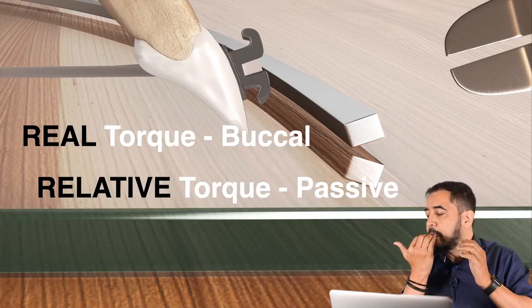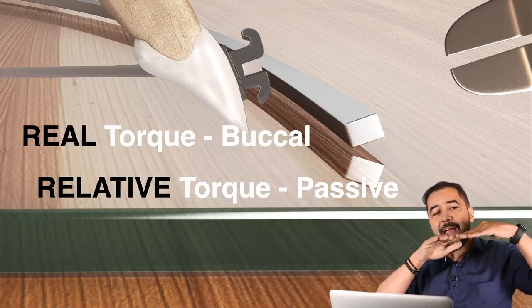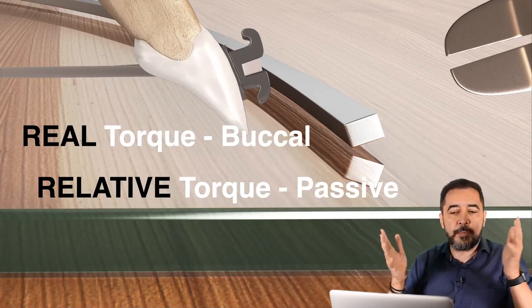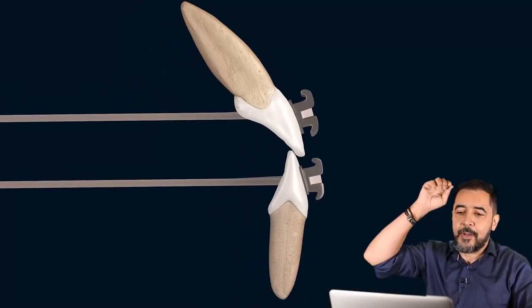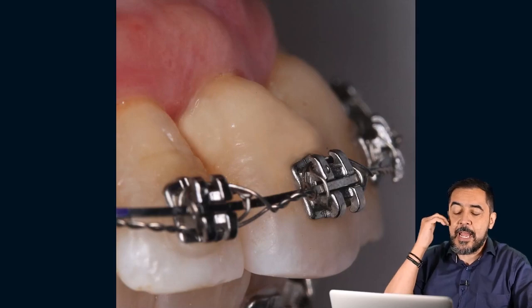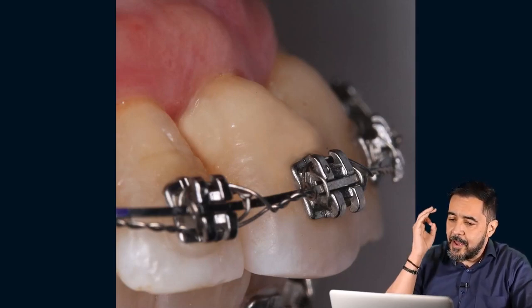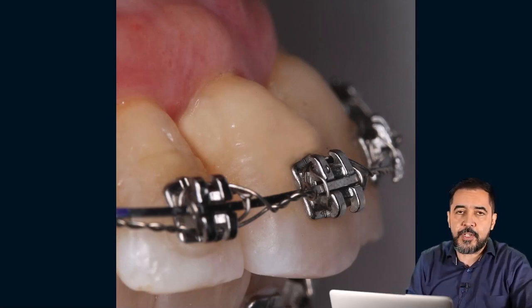So to see that, the height of the tip of our arch wire has to be at the same height as the tube of the first and second molars, okay? This is the most important thing till now. Guys, this is for me something very important, and anytime I have the opportunity, I say to my students, pay enough attention to that, because we can do harm to our patients, we can do something bad to our cases.